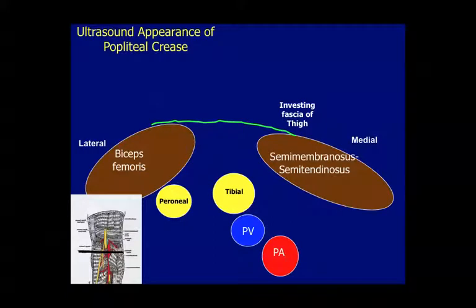This is at the level in the popliteal fossa where the sciatic nerve has bifurcated into the tibial and peroneal nerves. Once again, a conventional way to block this would be to bring the needle right down on top of the nerve and either seeking or getting a paresthesia and potentially causing some minor or severe nerve injury to the tibial nerve. Again, the same thing for the peroneal nerve.